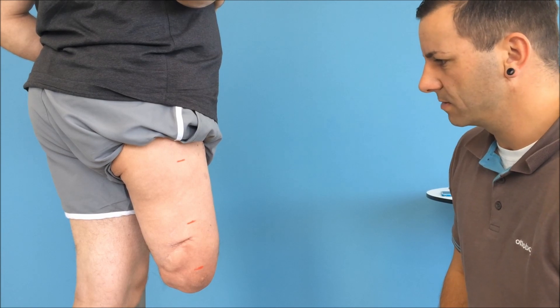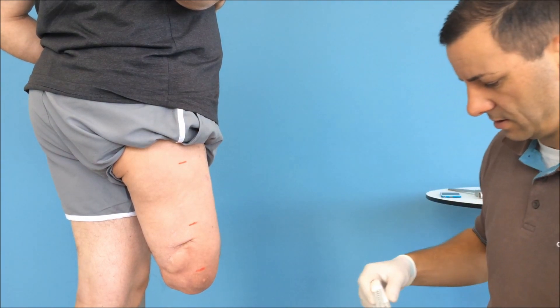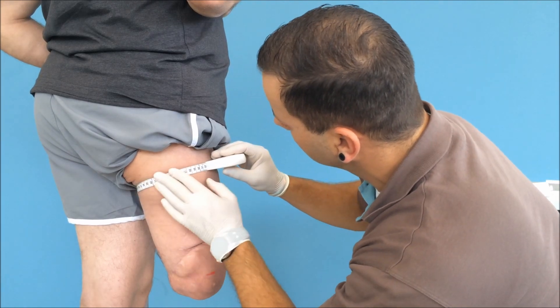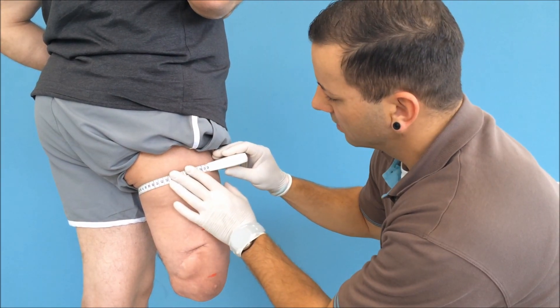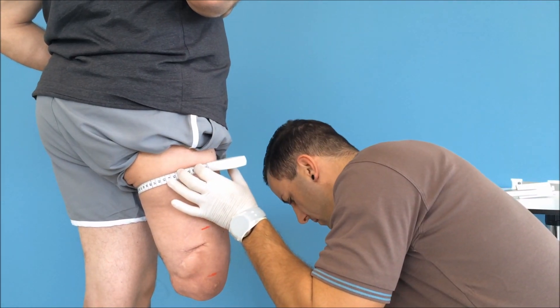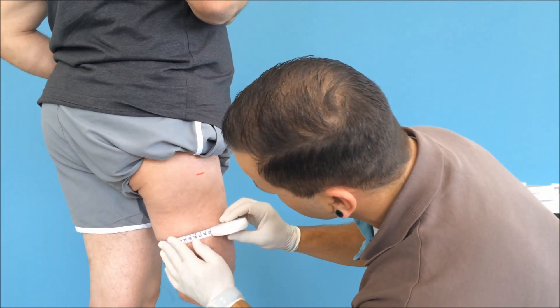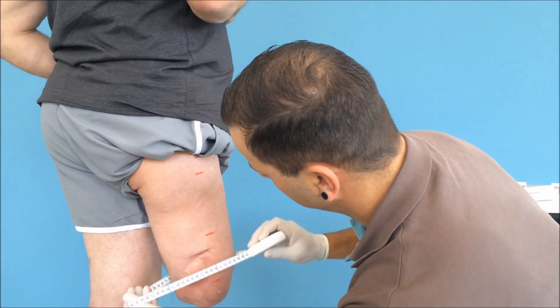After I've made a note of the height on the measurement form, I then measure the circumference directly at the marks we've made. We take the top measurement at a 90 degree angle. If the ischial tuberosity has been identified correctly, this dimension is at the same level as the perineum. I apply just a bit of pressure and make a note of this measurement. I do the same for the middle dimension and for the last one.